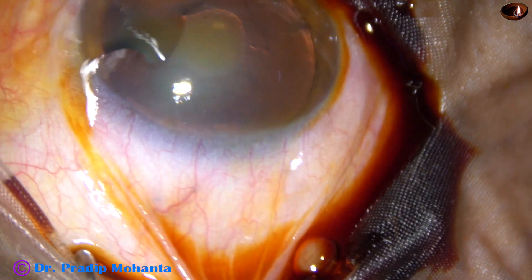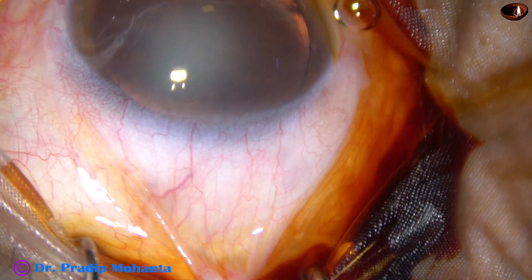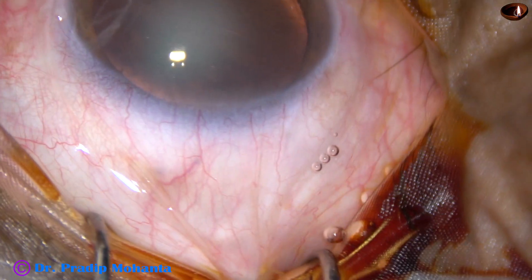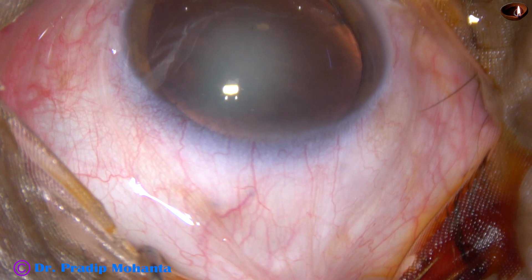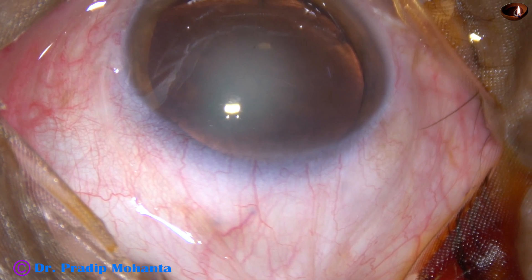Povidone iodine has been applied over the ocular surface and now the ocular surface is thoroughly irrigated by Ringer's lactate or balanced salt solution. And now you have to do peritomy — conjunctival peritomy.